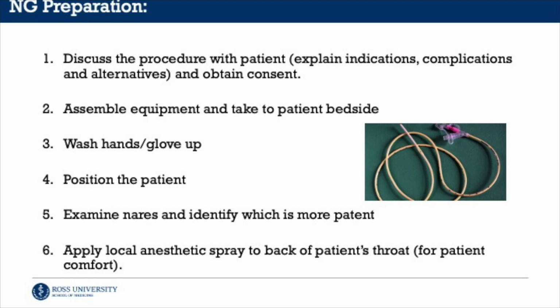And of course, apply local anesthetic spray to the back of the patient's throat for their comfort, as when you're placing the NG tube, it may cause slight discomfort without it. And then pictured, we have a nice example of an NG tube, just what it looks like.